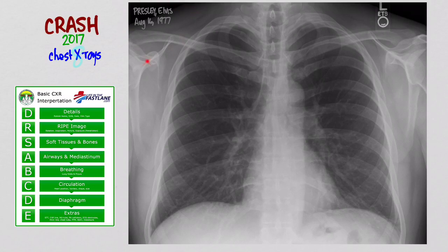So let's look at this X-ray. The first thing is D for details, and this really means that you have the correct X-ray. You're going to look at the top left of the film — it's going to have the patient's name, the date of the X-ray, the patient's date of birth, what kind of X-ray it is. You want to make sure you're looking at the right X-ray and not the wrong patient. That's D.